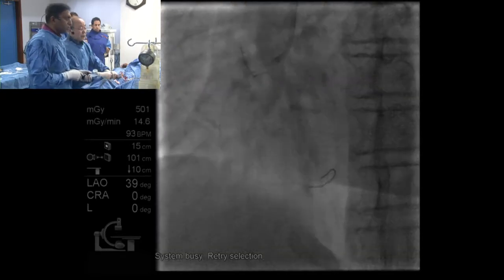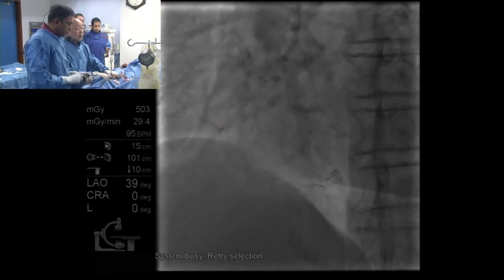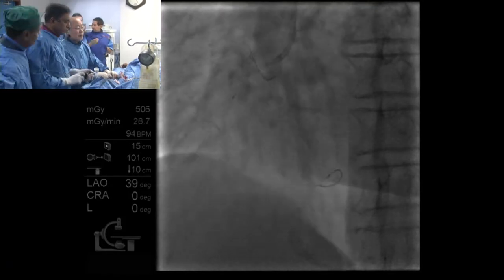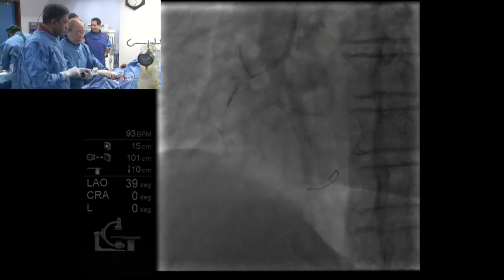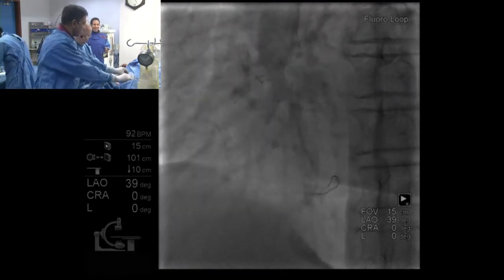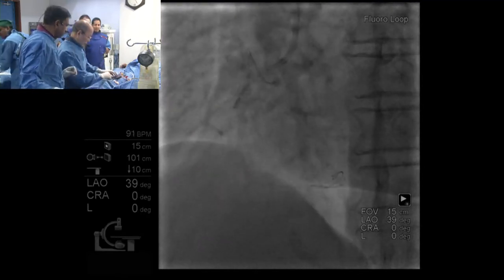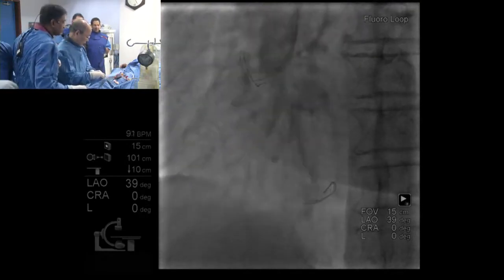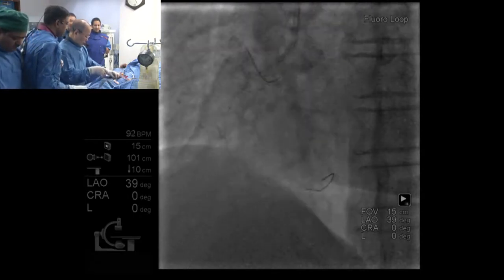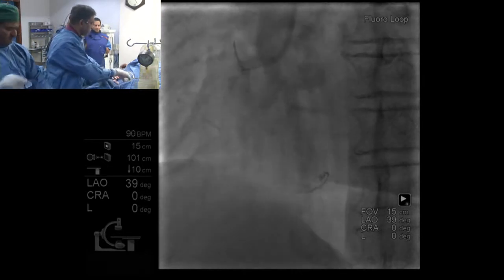Okay. And the 1.6. Okay. Take a check. Very tight. Oh, sorry. Okay.